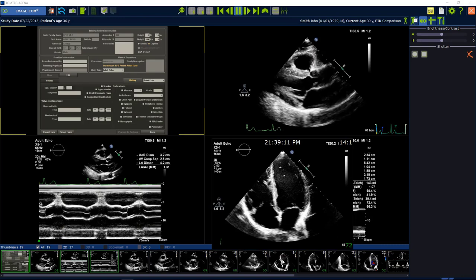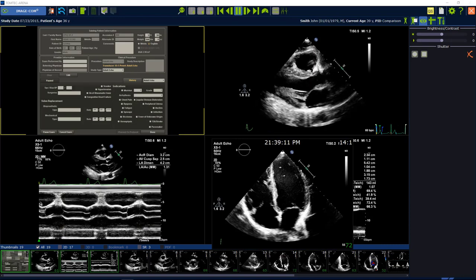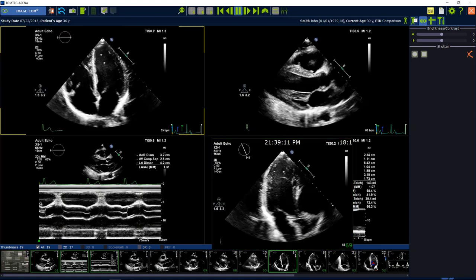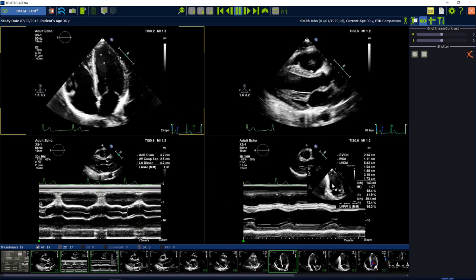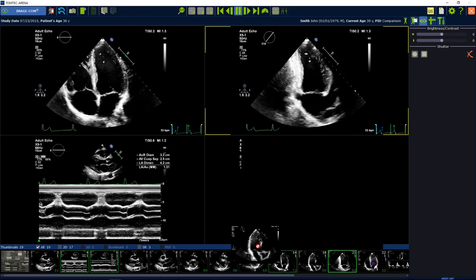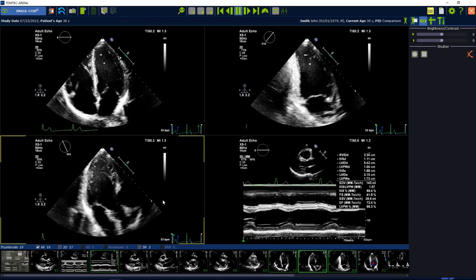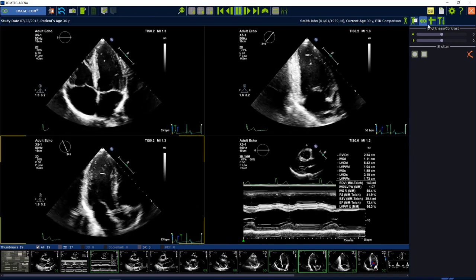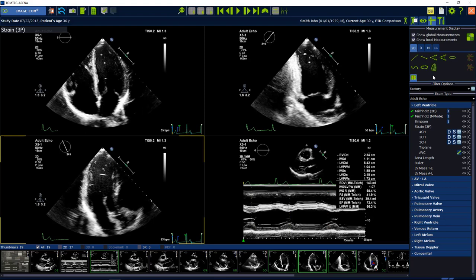To start the analysis, drag and drop an apical four-chamber view, two-chamber view, and three-chamber view into the workspace. Then open the measurements package, select the left ventricle, and then select the strain three-plane button.